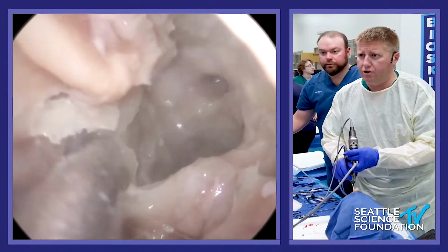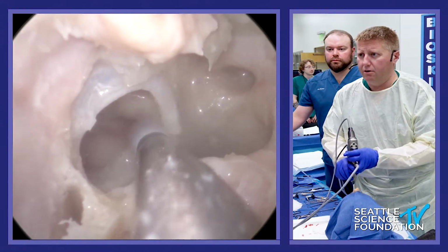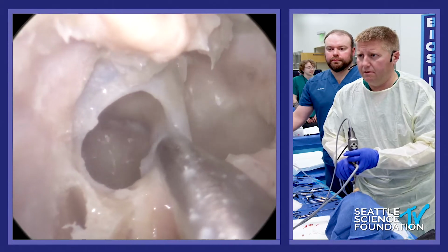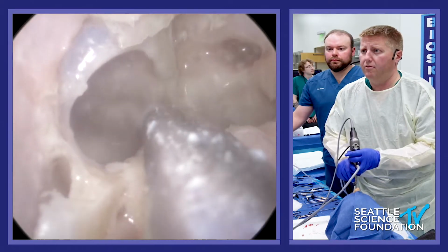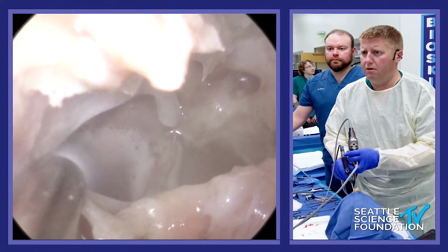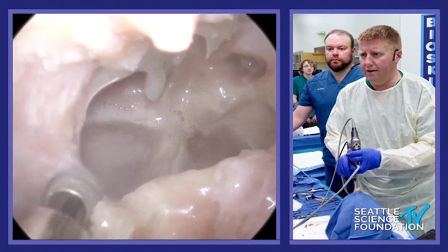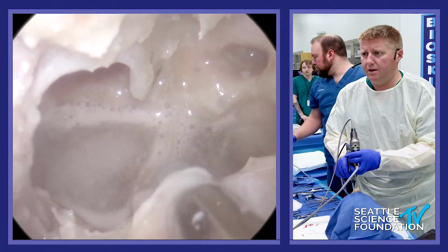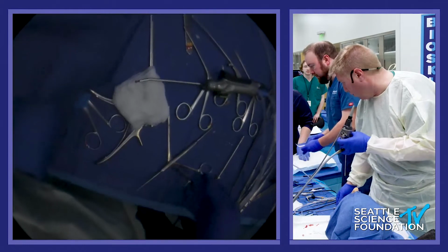So now you can see we're in the contralateral side. And what we're doing now, again, this is all just an access issue. We're removing this sphenoid septum, trying to gain access to that sella. And we'll drill as much as we can here. You want to smooth out any of these rough, bony edges. They have a tendency to crust a lot. And you also want to make sure, again, that you're giving your neurosurgeon and you plenty of space to work.